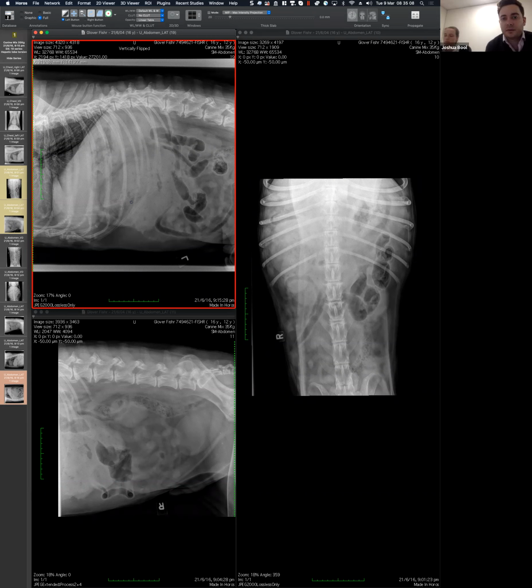I think, sorry, you get one. Thanks. The gas makes me concerned there's necrosis or infection in it. So it could be a necrotic tumor in the spleen, or it could be torsion. But I think to get necrotic from a torsion, probably the dog would be dead. So probably a necrotic tumor.